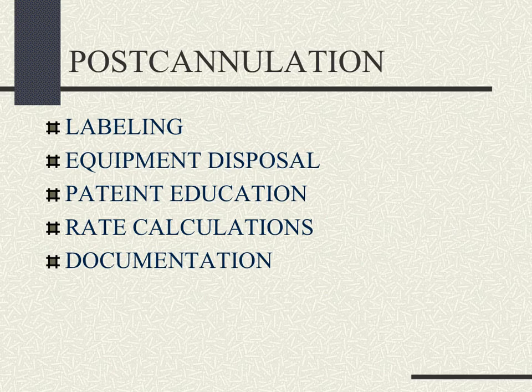From the post-cannulation standpoint, we must label the information about the IV. We must dispose of equipment appropriately into the appropriate sharps containers if necessary. Patient education is key. We must calculate our rates for the IV infusion, and we must document all of this in the patient's nursing notes. This is the end of Module 5.